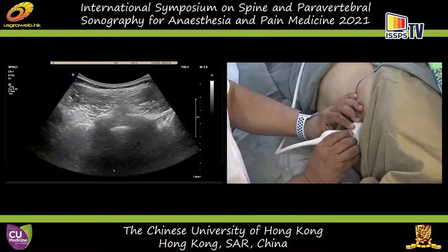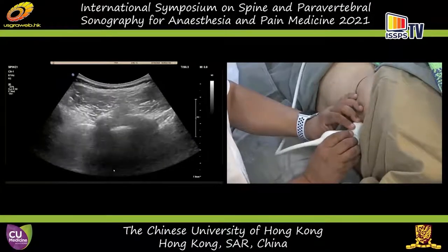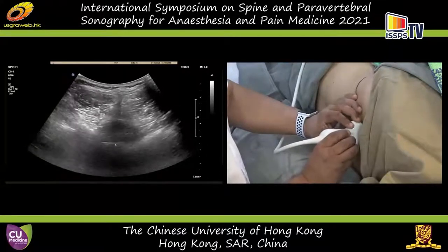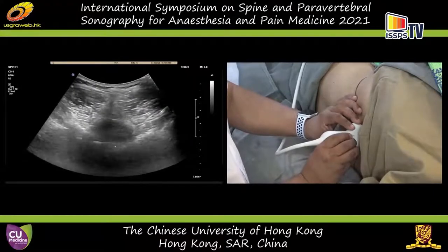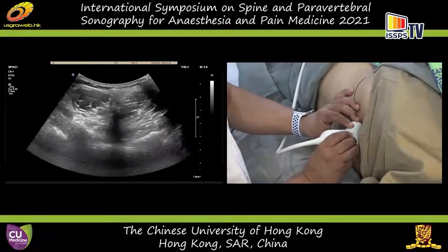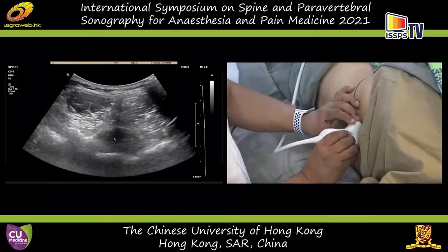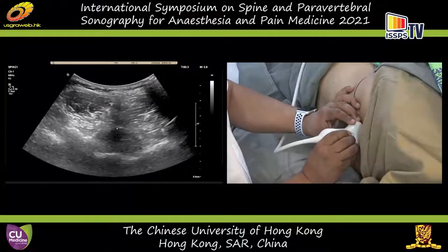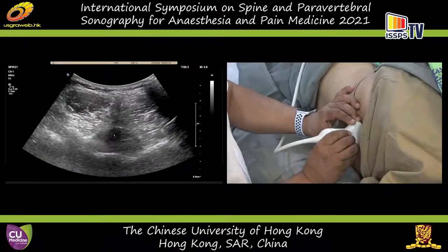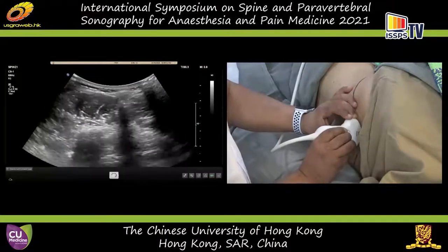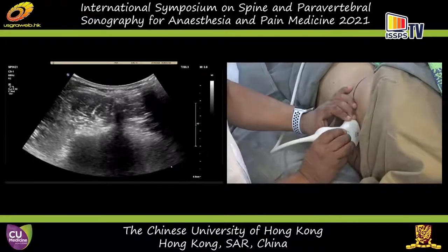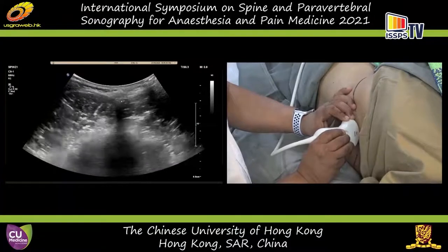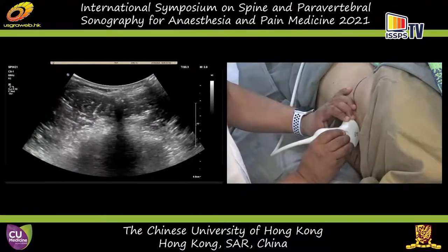He has some ossification in the sacrum itself. As you go cephalad, you'll see the lumbosacral junction. This is the anterior complex. You can see the lateral elements, and the thecal sac would be in the middle. You can see the posterior dura here and the dark space in the middle — that is your thecal sac. If I go more proximally you can see L5. This is the spinous process of L5 — you can use this to identify the midline.